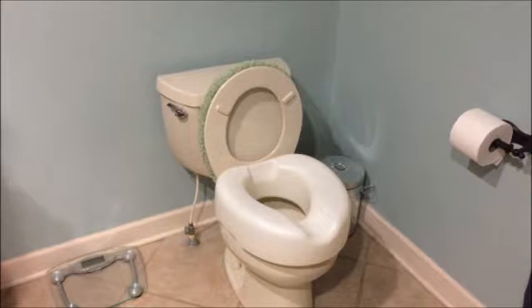The raised toilet seat can be added to a toilet in order to increase its height. Increasing this height can make it safer and easier to get on and off the toilet.